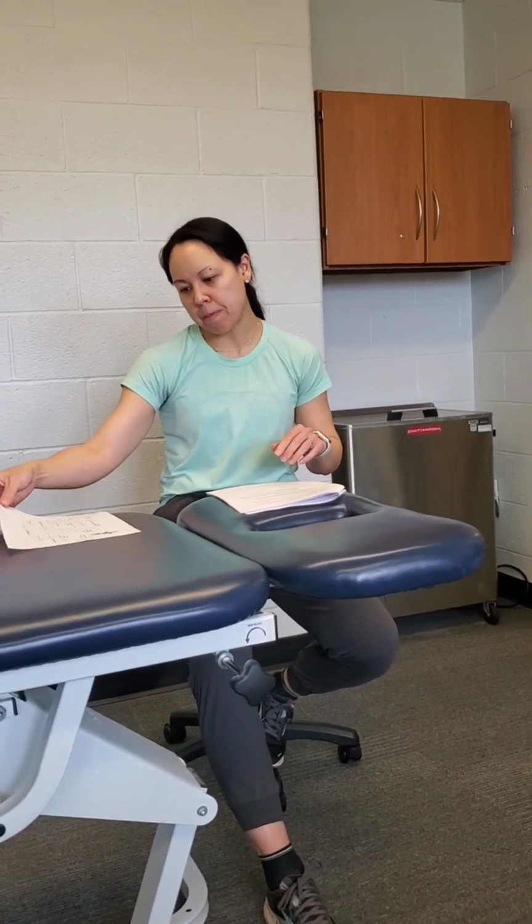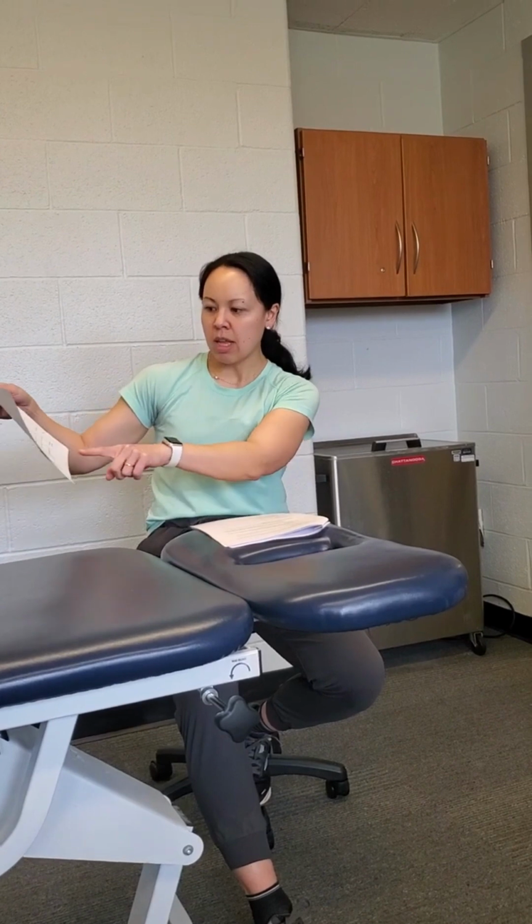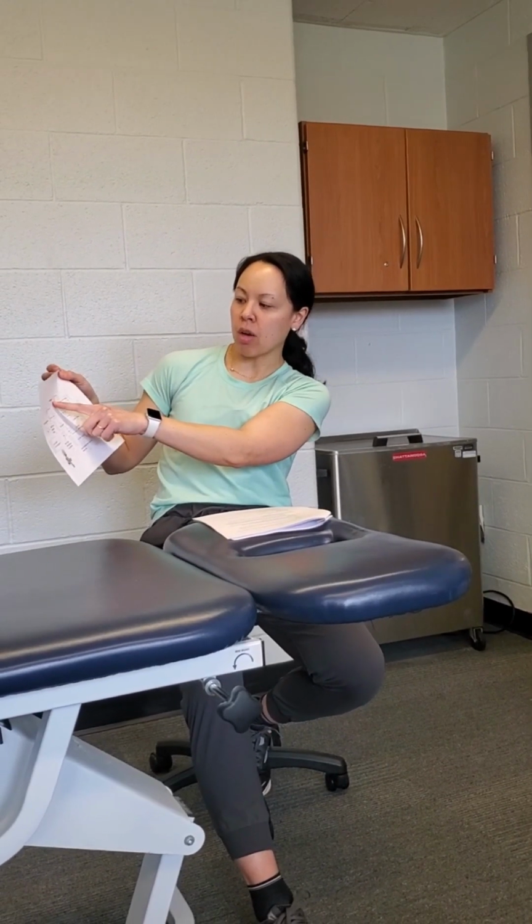I mean, you may want to monitor them and make sure it's safe for them to do it, maybe. And we'll talk about it, it didn't print off very well, but it's better in the slideshow I sent you, in terms of, can I do BFR with my patient? Do they have thrombophilia? Yes or no?